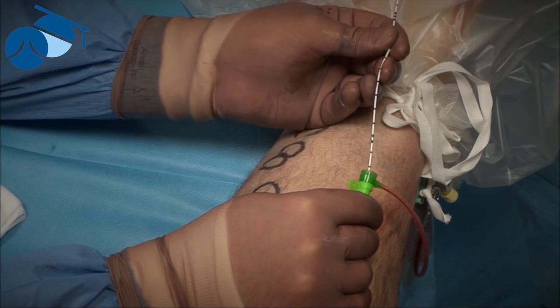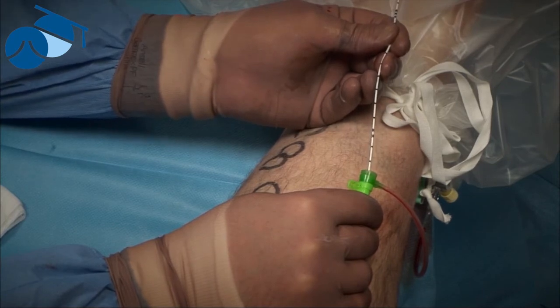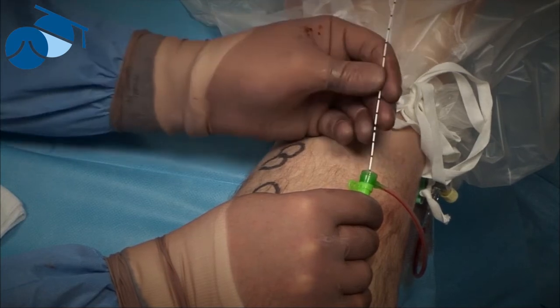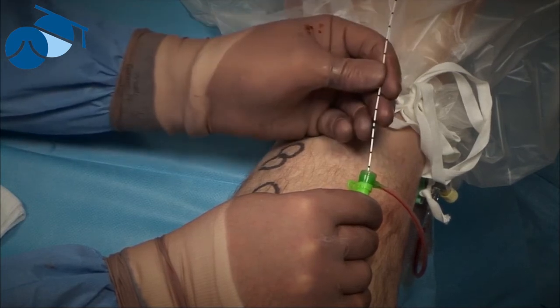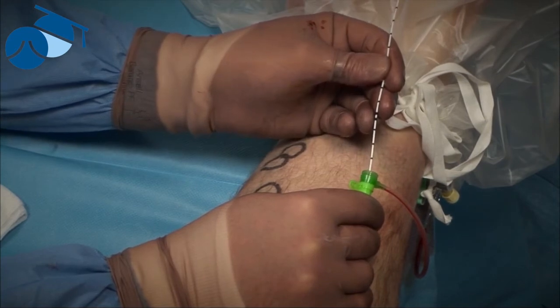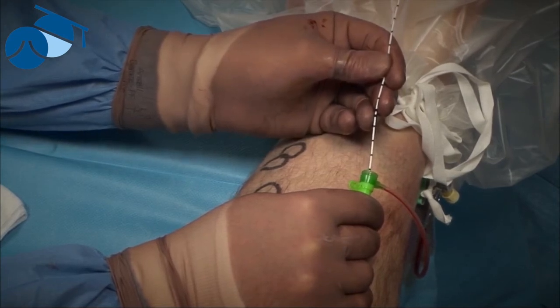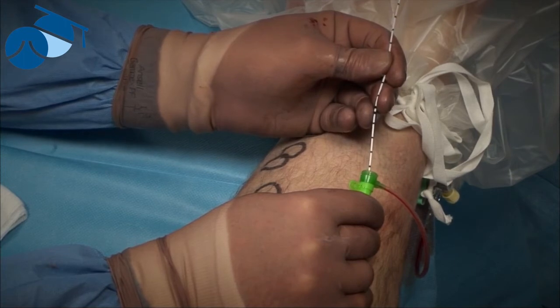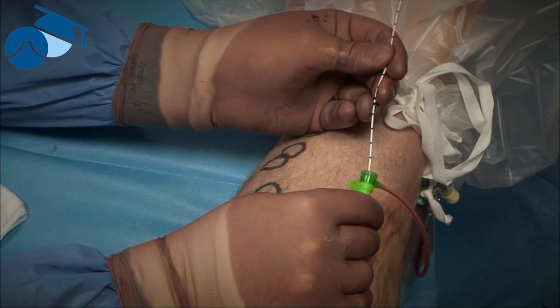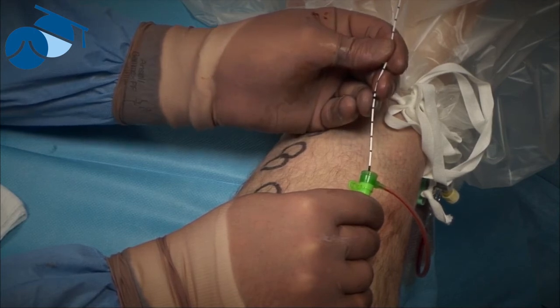When you come on to over 90, you're putting so much energy into it, you're starting to charcoalize the vein, and that causes an immense amount of pain. So we have seen people putting 120 joules per centimetre into veins, and those patients are usually in almost as much agony as the stripping. We're trying to coagulate this vein away rather than cause it to charcoalize or perforate.